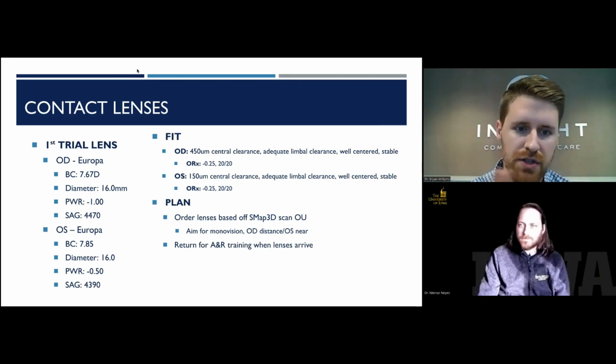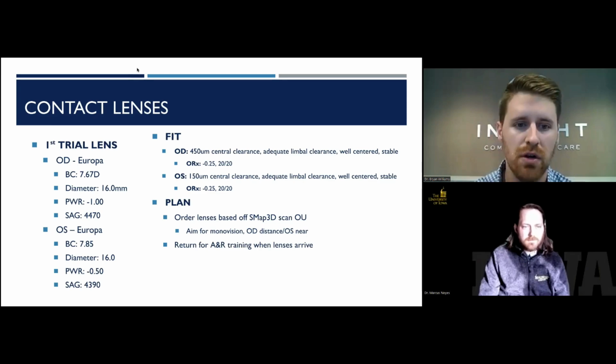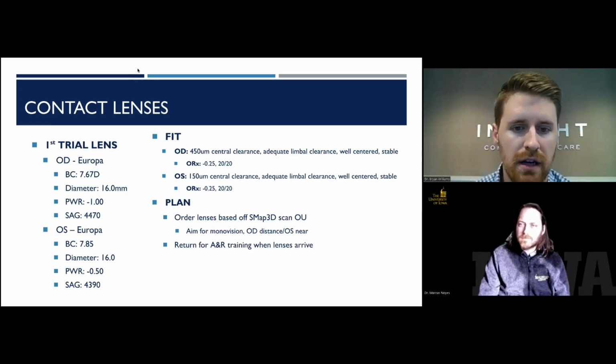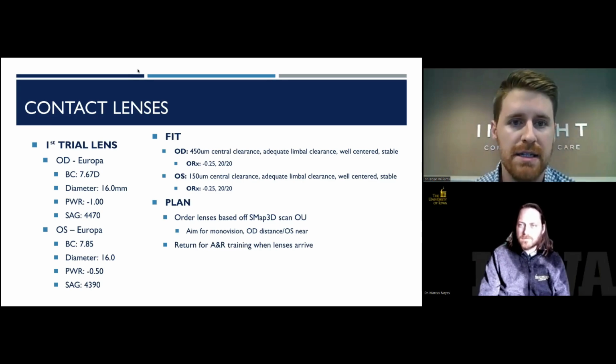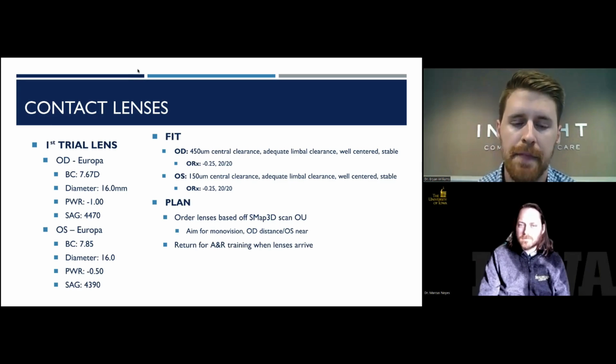And with the amount of scarring and irregularity, the contour of her sclera just did not look very regular. I was confident we could get to a good landing spot, but the SMAP is definitely a tool I fall back on quite a bit if I'm trying to get to that end spot and cut down on the amount of follow-up visits much sooner.